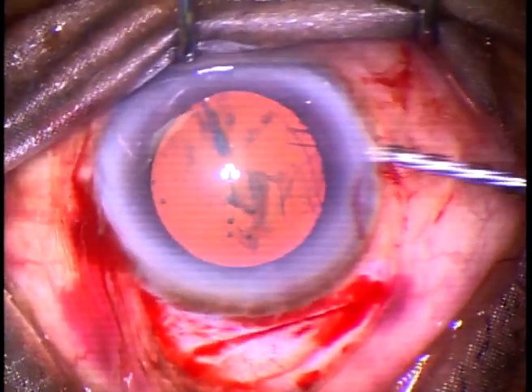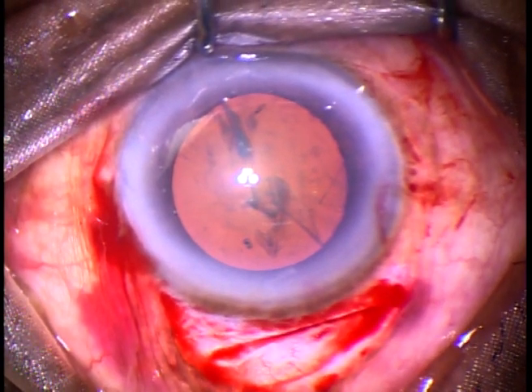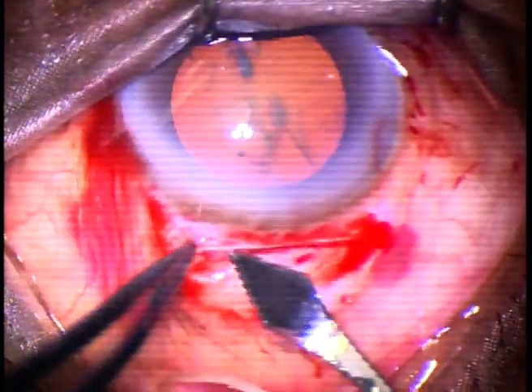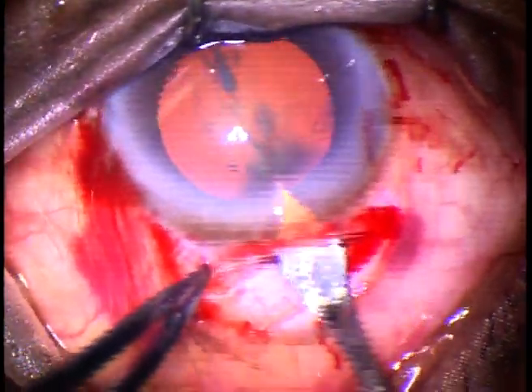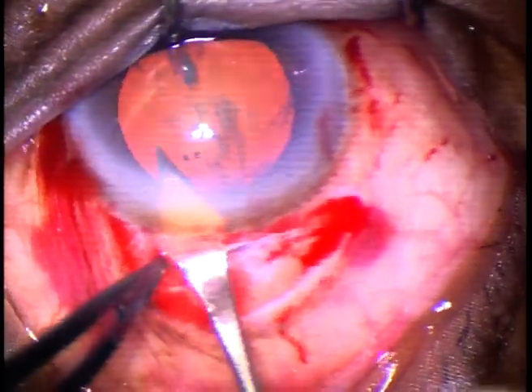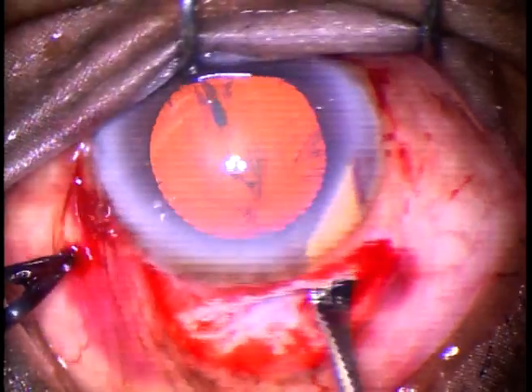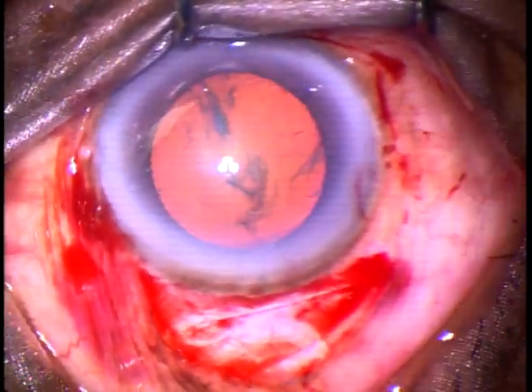And now, we are going to open the tunnel. Go to the anterior extreme of the Sclerocorneal Tunnel, then enter into the anterior chamber. Cut when you go forward — cut from one end to the other end. And you have opened the tunnel.